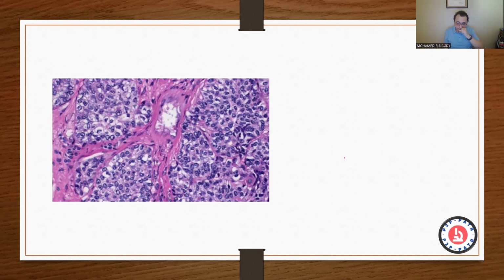This entity is very important to always put in the back of your mind. You might think that this is clear cell, but there are no thin, fine vascular arborizations. You remember the thin, fine arborizing blood vessels that we talked about in the previous session? You cannot see them here. You see big, huge nests of cells which have kind of clear cytoplasm, and they don't qualify as a clear cell. They don't even honestly qualify as a clear cell papillary either. And you can do the immunos, you can do CK7, CA9, and CD10. They will disqualify it as being neither clear cell nor clear cell papillary.